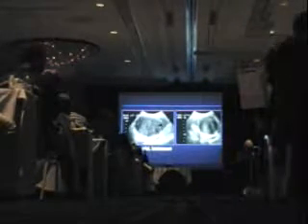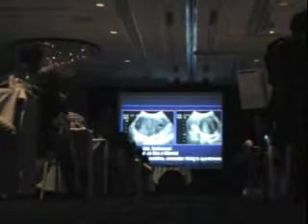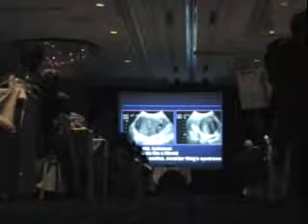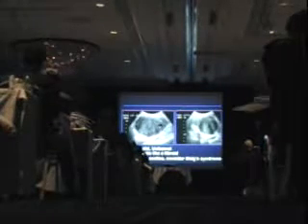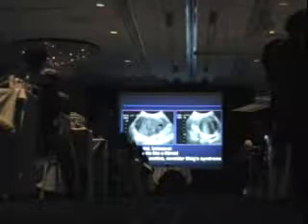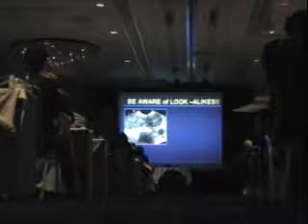I wish there was a little more attenuation of sound from within the mass here, because if I thought that was from an ovary, and it looks like a fibroid, and especially if I saw ascites, I would think of Meigs syndrome, which is due to what? An ovarian, like the word fibroid, fibroma, a benign tumor, often associated with ascites.